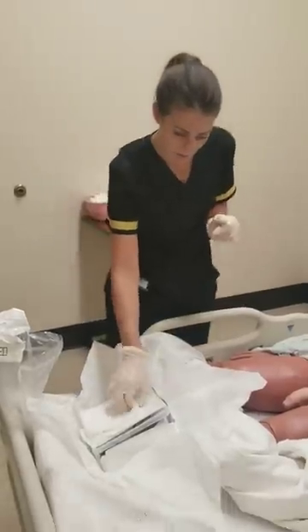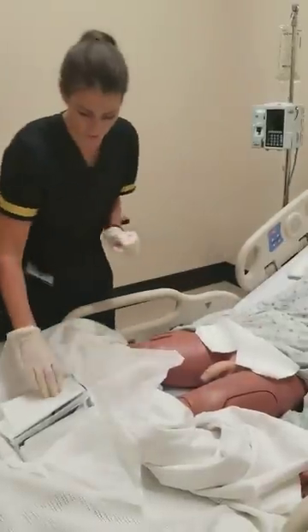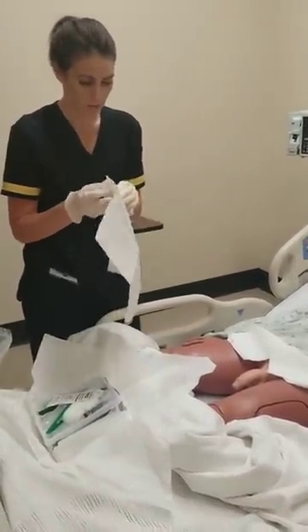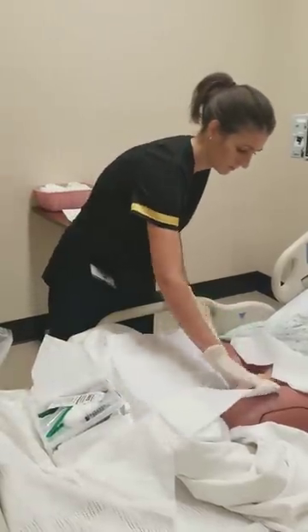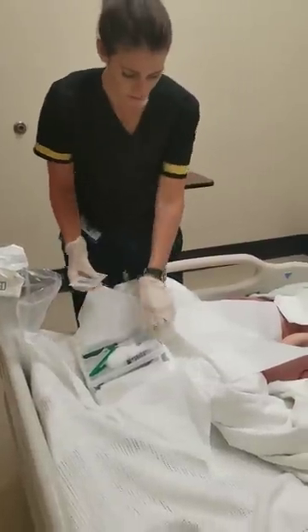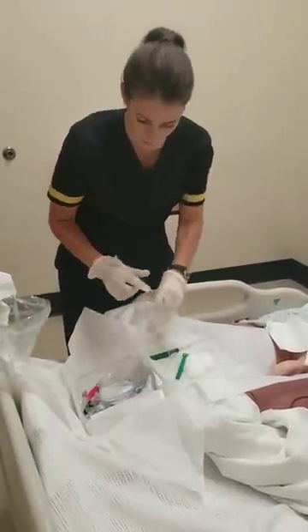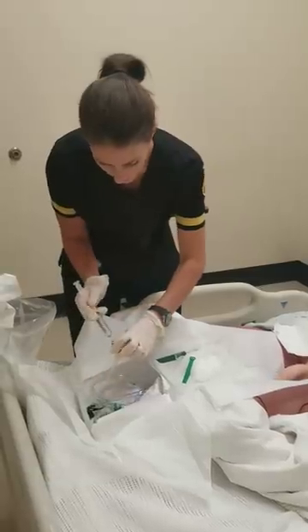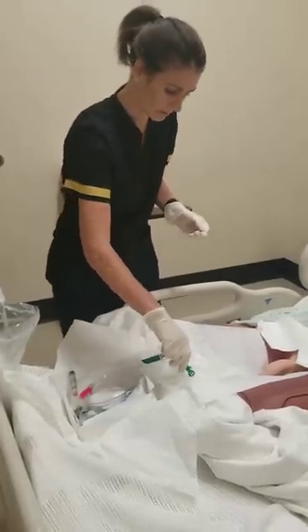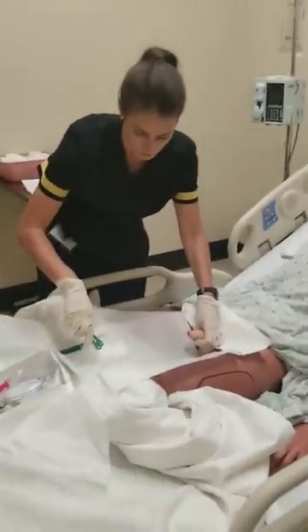And let's go ahead and place this on you. It's going to keep us from having so much of a mess and give us a little bit more of an area to work with. I'm going to place this shiny side down. Go ahead and put some betadine on these cotton balls and let that soak for a minute. I'll put my syringe here, just to make it a little easier to work with. With these cotton balls, what I'm going to do now is clean everything in a circular motion.